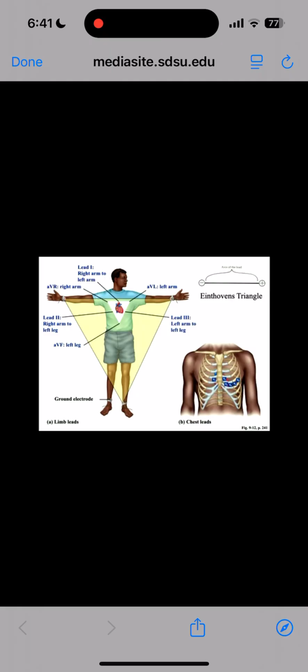Now, in a true ECG these days, we have 12 leads that we look at. From Einthoven's 3 leads, we also have something that's called AVR, AVL, and AVF. So here's AVF, here's AVL, and AVR. These are a more complex way of looking at the leads. And then we also have 6 chest leads. So in total, there are 12 leads. All of the AVR, AVL, AVF, and the chest leads are what we call unipolar leads, which means they use complicated mathematical algorithms and the recording device or computer to look at the dipole from whatever position they're looking from.